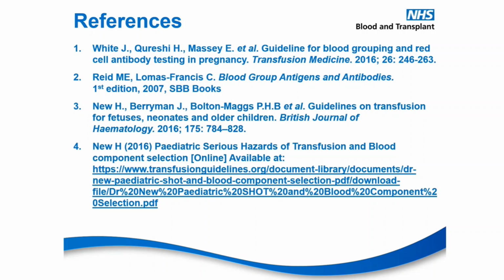We tend to deal with them for the unrelated organ donor matching program. So these tend to be for us either kidney transplant patients or BMT patients that are having an ABO mismatched graft, and we monitor the anti-A and the anti-B levels for them. So that's where we come into play for that.